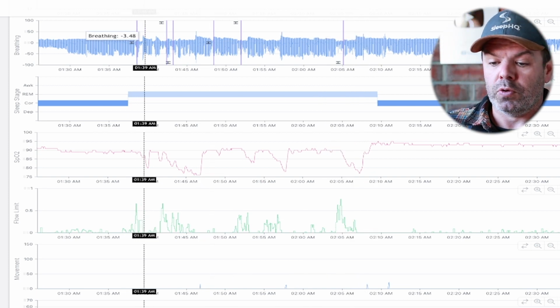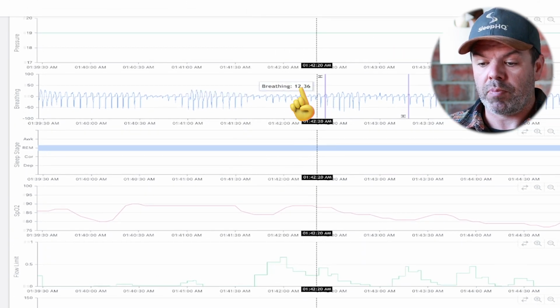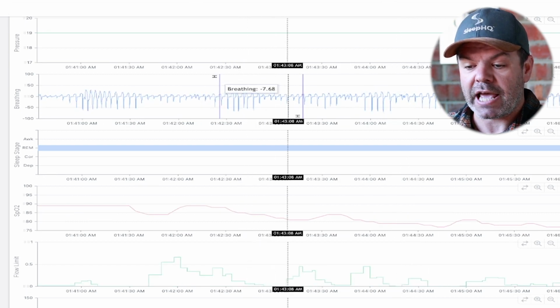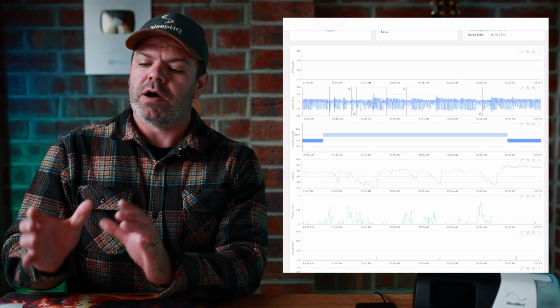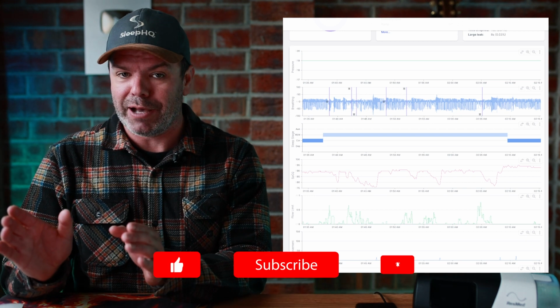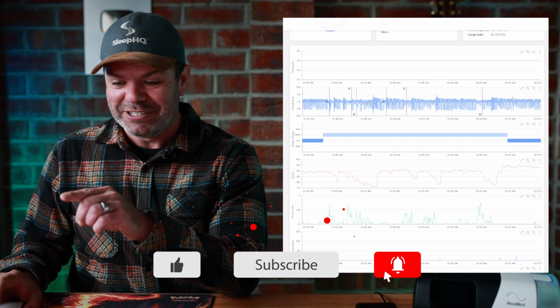And if we zoom in a little more, you can see here we have the therapy flags, hypopnea flags. And we can see this unstable breathing pattern and the drop in oxygen. Right, how cool is that? So right now, all the charts are in perfect harmony. Everything is lining up like a dream. And that is exactly what Jay's doing right here, dreaming.